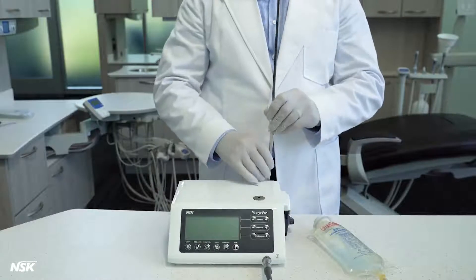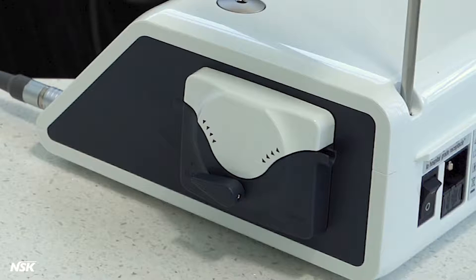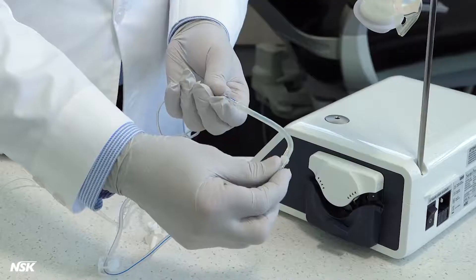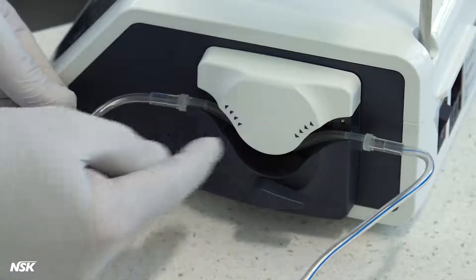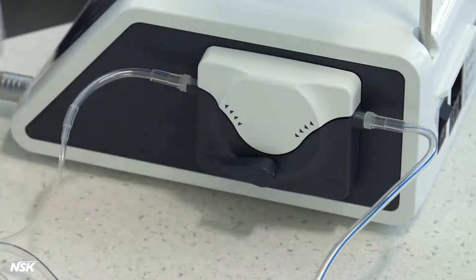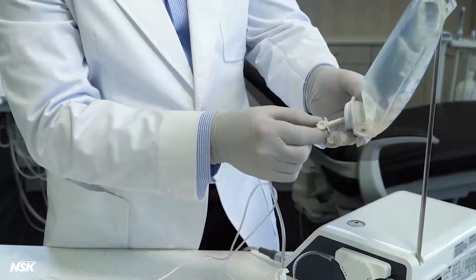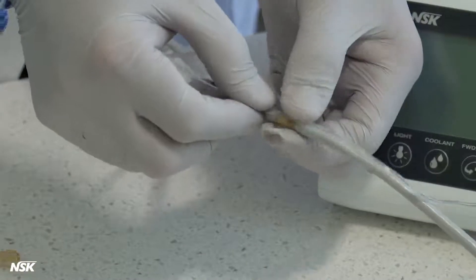Next, mount the coolant solution hanger post and hang the saline bag. To install the irrigation tube, be sure the lever of the pump is turned to open and the needle end of the tubing is facing toward the back of the unit. Then bend the tubing and insert inside the spindle. Make sure the two stoppers on the tubing stay outside the pump, then turn the lever back to close. Clamp the irrigation tube to stop the flow of fluid and insert the needle at the end of it into the saline bag. Attach the irrigation tube to the cord using seven holders, which are autoclavable.